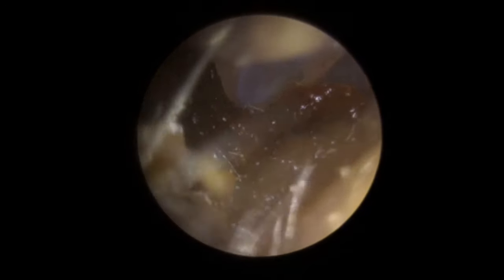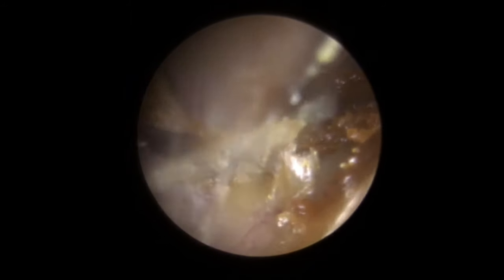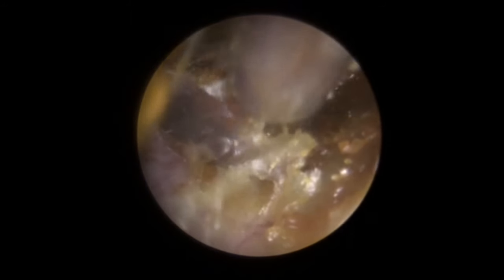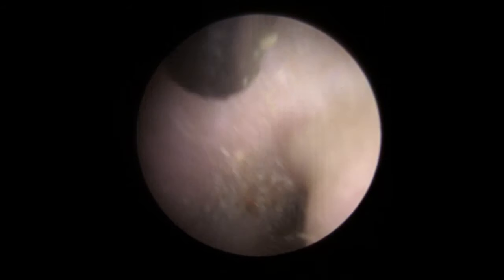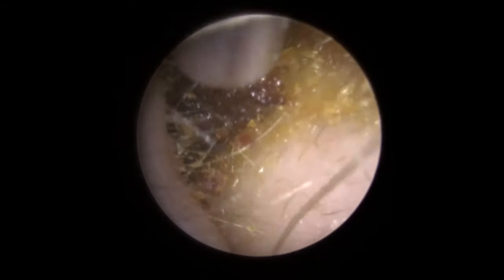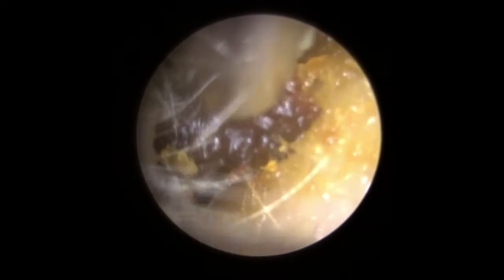So you can get a good look at it. When we look back in now, we'll notice we've still got that base section there — that's still attached to the canal wall. So if we get a grip on the side of this, it should lift the whole thing up — now there's nothing above it, which means we can really peel up to the roof. There we go — that gets a nice big section away. Very dark in colour. It snapped about halfway out of the ear canal, so it got sucked into the end of the tube. Let's get the remainder back out.